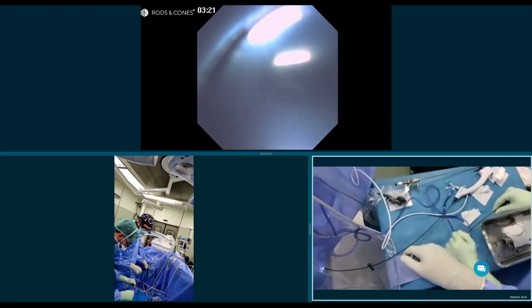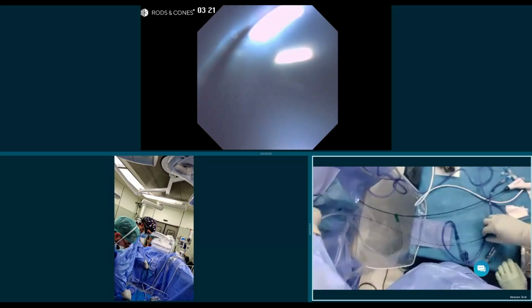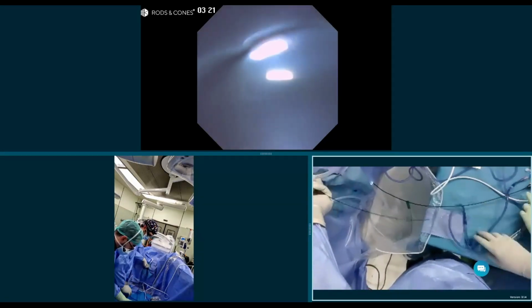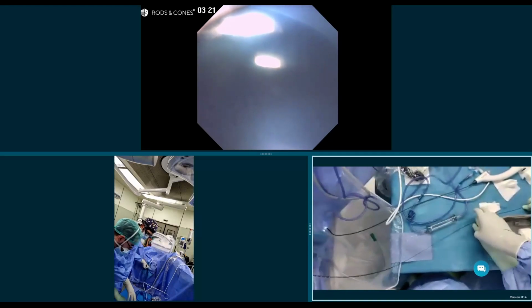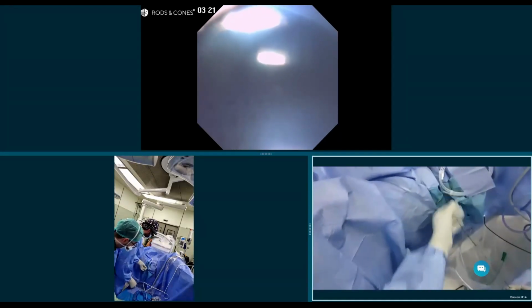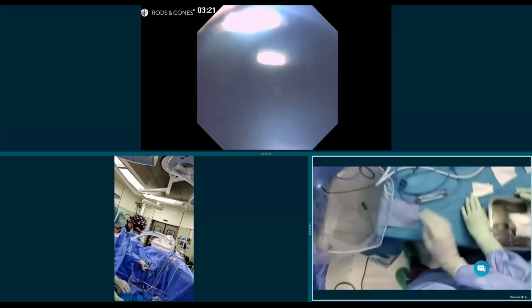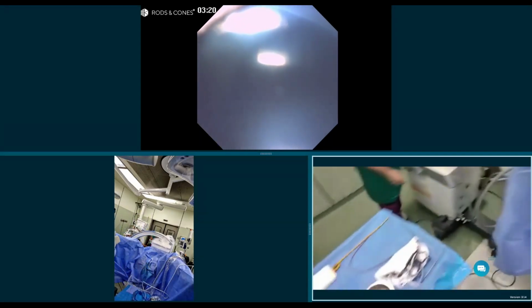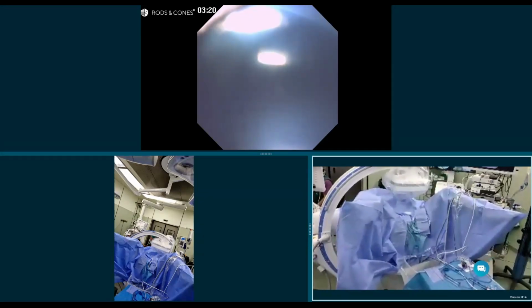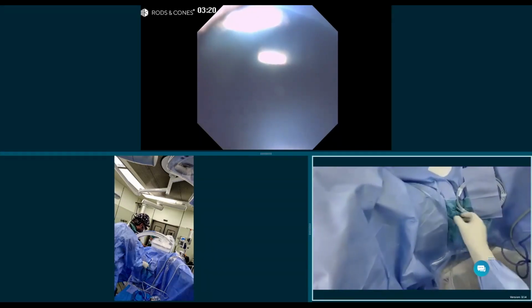Okay, so we're placing the stent, 6 French 24 centimeter stent. Excellent. So put it like this. You can see the table is prepared for everything. I just grab it here, put the whole thing over there. So just one. You can see that the stent is already in the upper pole.